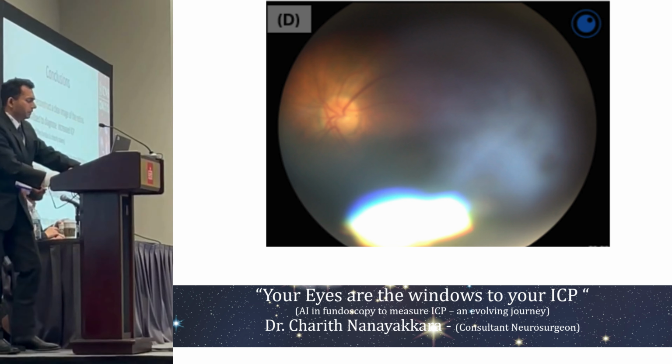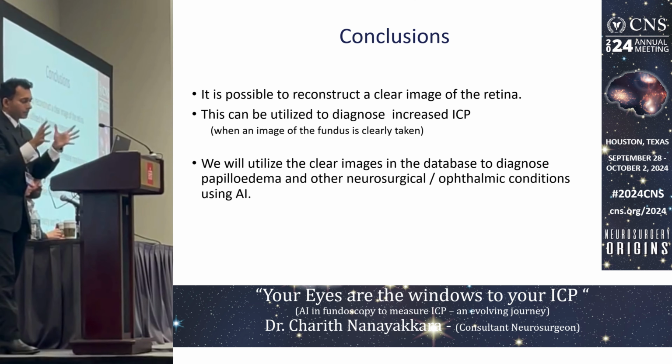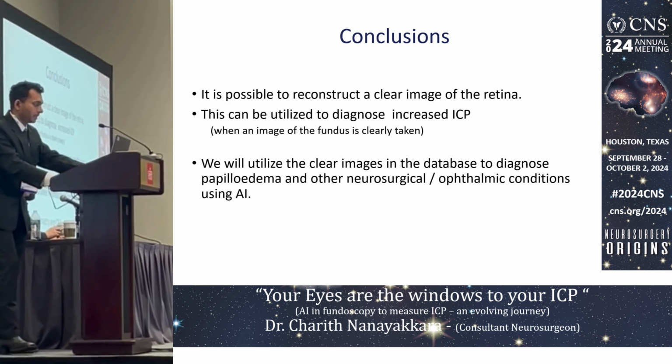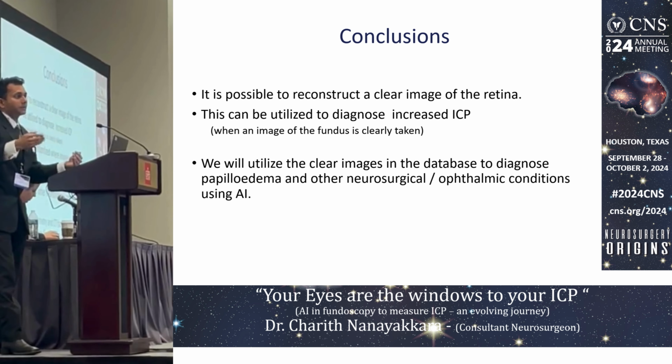Right, so the conclusion is it is possible to reconstruct a clear image using this apparatus. Using this technique, we can reconstruct and record the fundus very clearly using this portable device. This can be utilized to diagnose increased intracranial pressure when an image is collected. It can be further standardized where invasive monitoring is used as well. So those are the future endeavors that we have to cross.